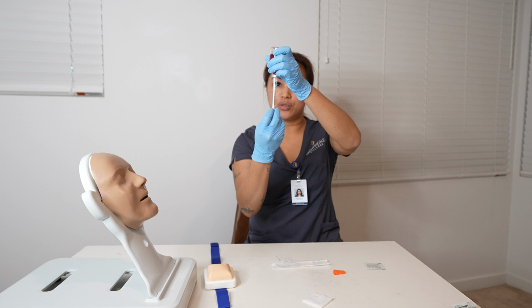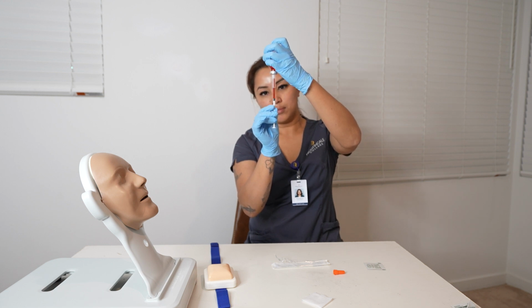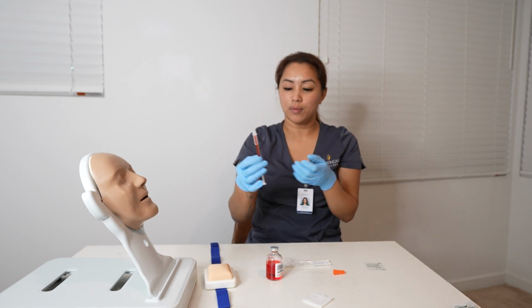Now we are going to draw 1 ml of the heparin, making sure that there are no air bubbles. Perfect, no air bubbles. There we go.